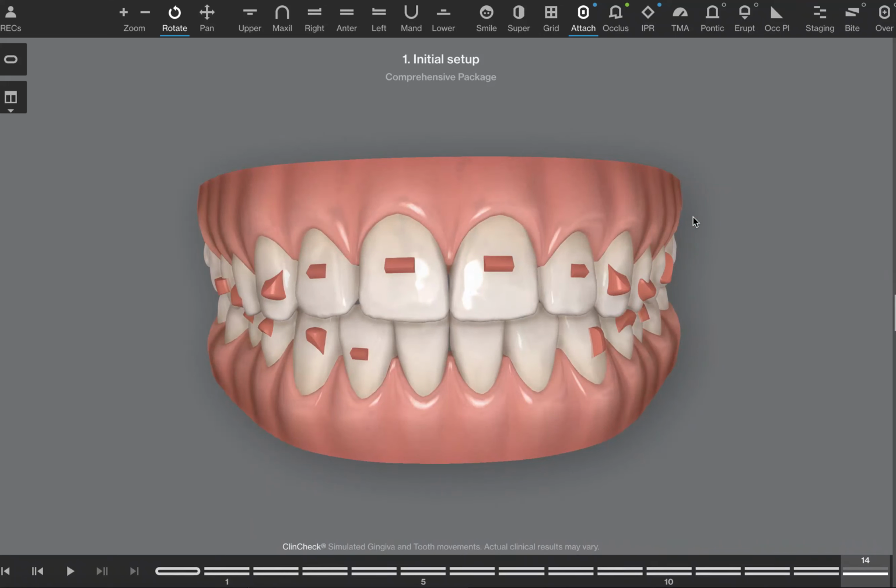I will let you know once I'm done with the clin check. I'm going to wait until you're done with the sleep study. I'll have Ray reach out. We'll get that information in. In the meantime, I'll be detailing this clin check treatment proposal, and then I'll hit send once I get the sleep information. Probably a week later, the trays will be in. So I would say the next 3 to 4 weeks we should be good.